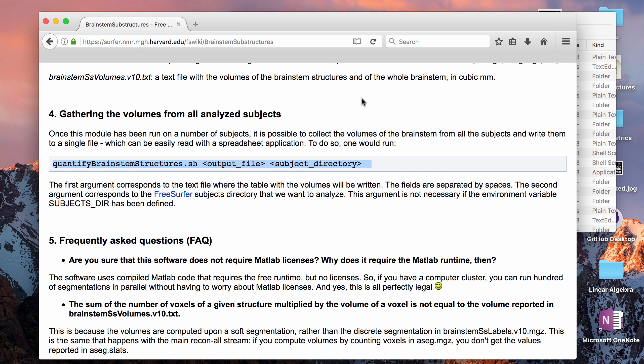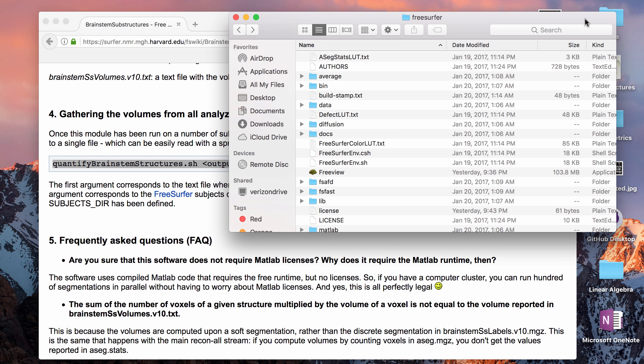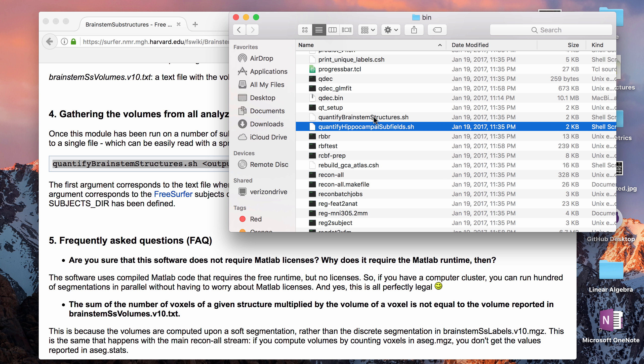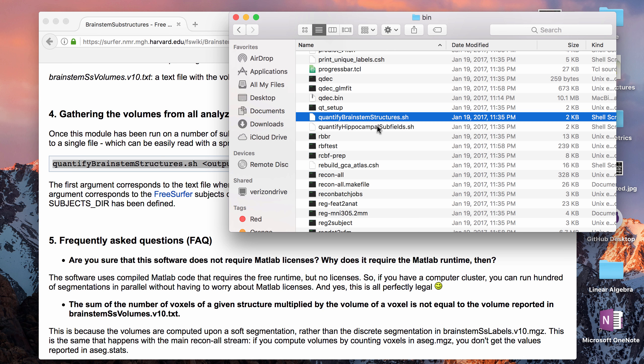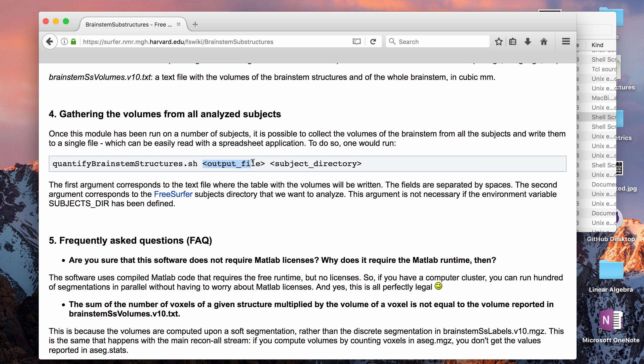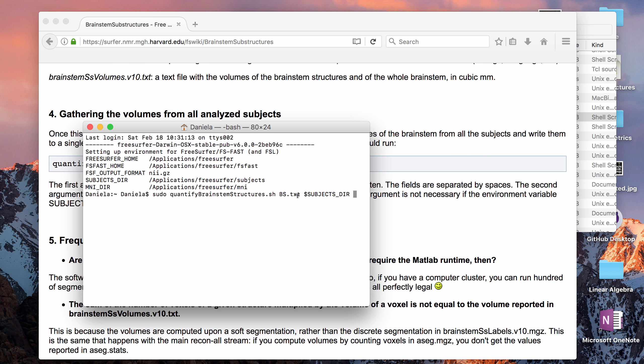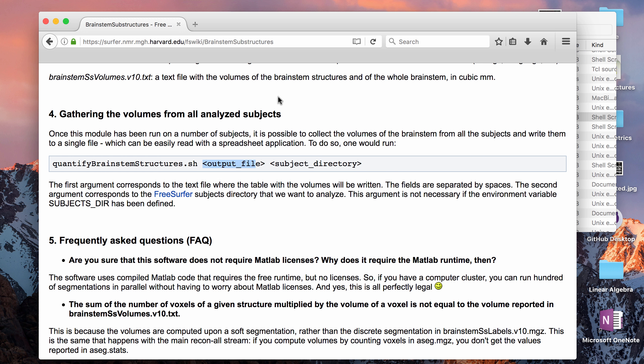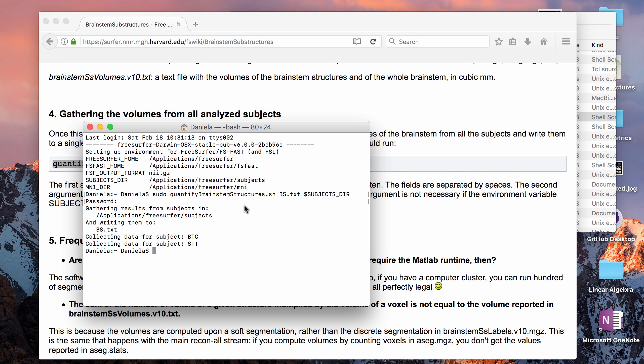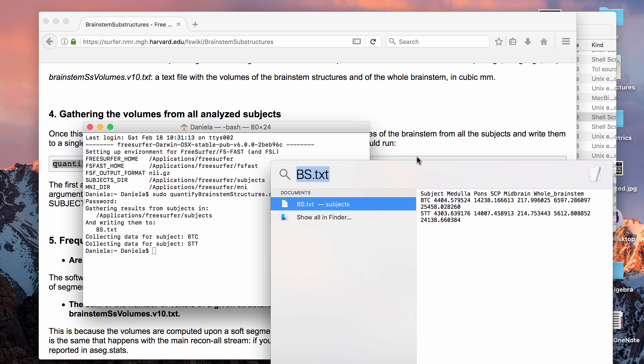This shell script quantify_brainstem_structures is in the bin of the FreeSurfer folder. To run it on my laptop I have to do sudo first just to make sure I have permission to access the folders. Then the bash script. The first argument is the output file, so you can just put whatever name of the text file that you want to be outputted, and then it tells you to put the subject directory. That's optional if you have already defined what the subject directory is. So I have two subjects in my subject directory that have the brainstem data, so that will write morphometry data from my two subjects to the same text file called BS for brainstem.